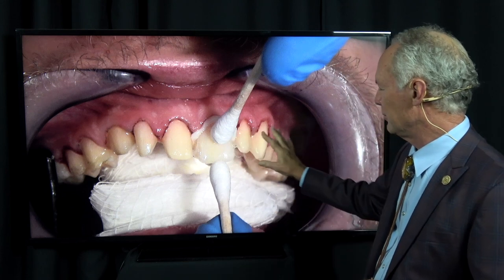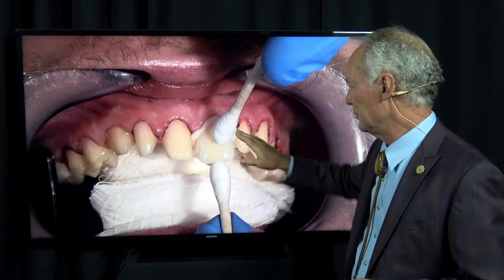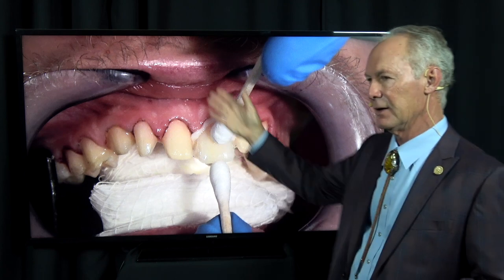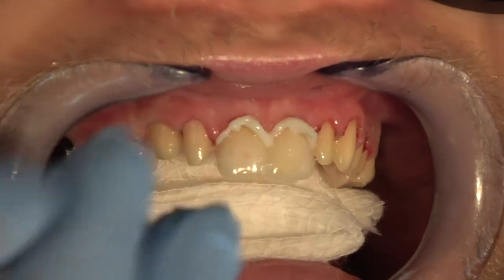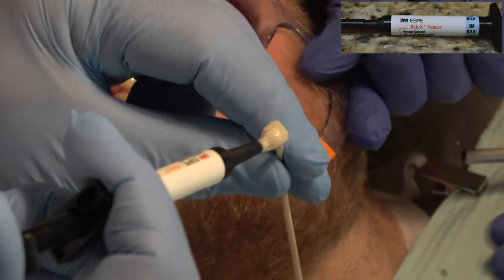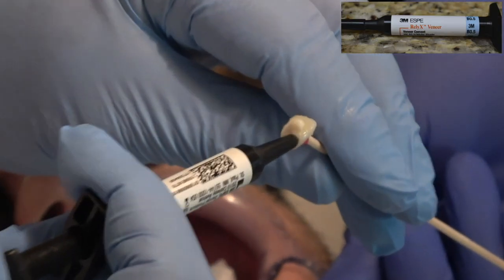The other thing is, if you put them all on at the same time and you tried them in ahead of time, you know they fit ideally, and the interproximal contacts are correct. So I don't want them to swim just a little bit, and now I'm putting this one on, and it doesn't go down. So I like to put them on all at the same time. Now, before I put them on, I turn the lights off in the room, and I have only the overhead light on, and I turn it down toward the patient's toes so there's just a light glow on the mouth, because you don't want the light in the room or in the overhead light to cause the cement to set up prematurely.